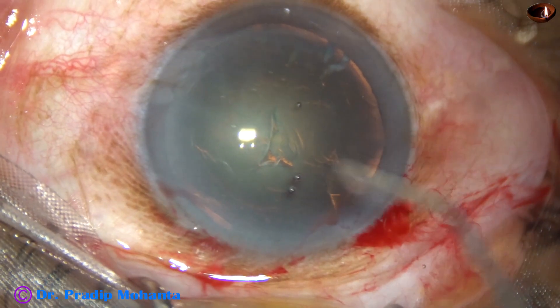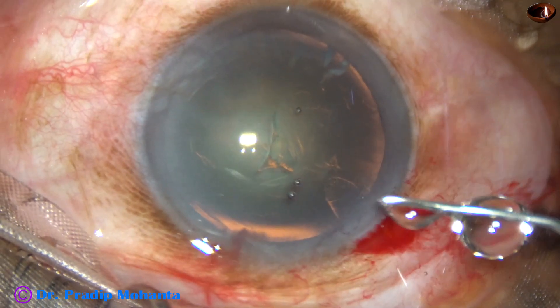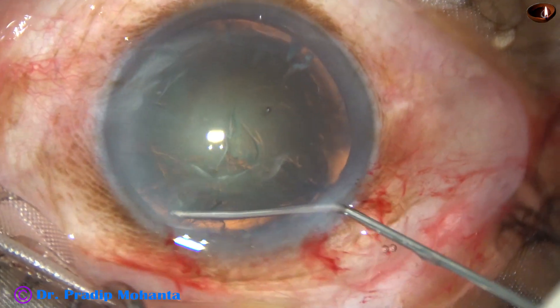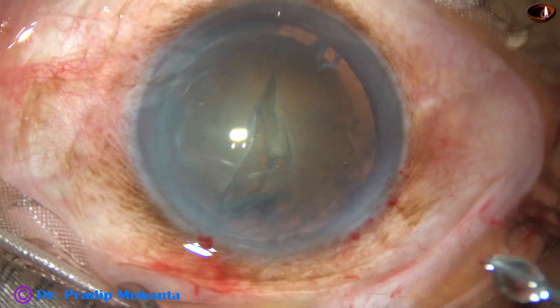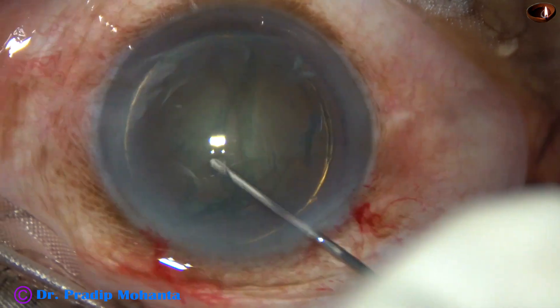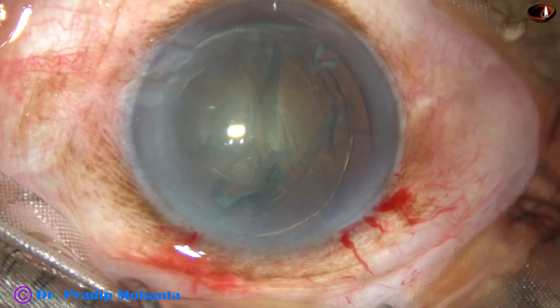Now hydrodissection. Hydrodissection is done with the help of a 27-gauge cannula and BSS. Hydrodelineation is also attempted, and it has produced a golden ring in this case.